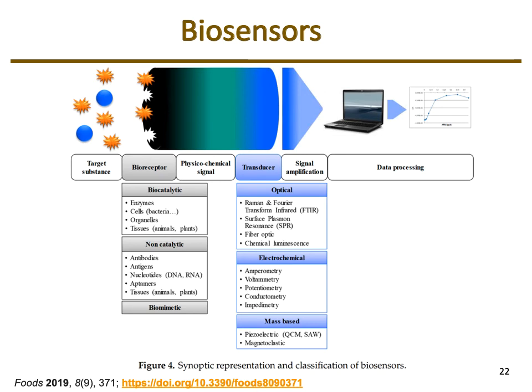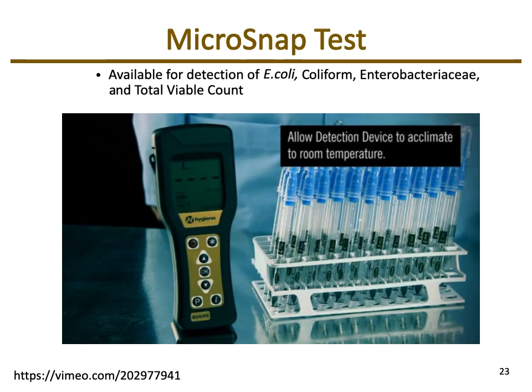Okay, so there are a number of different platforms, companies that do biosensors. I just selected one of them to highlight. No financial contributions are given to me, so it's not that I'm picking one over another because I'm benefiting from it. I just wanted you to be aware that there are different platforms. And just looking at one of them is this MicroSnap test.